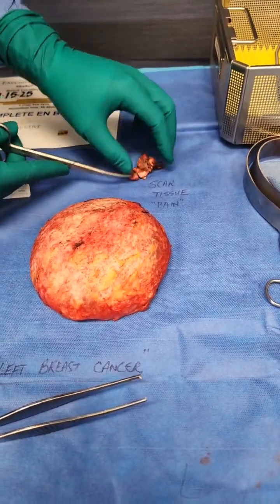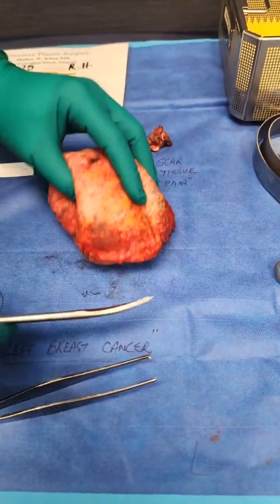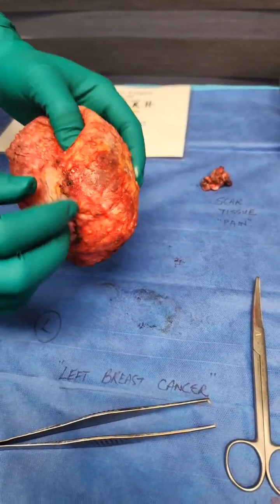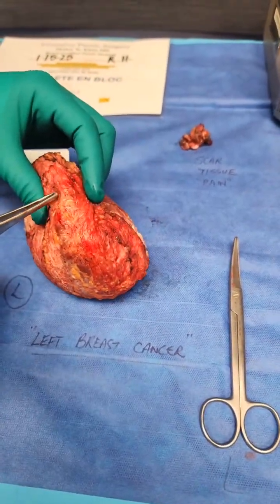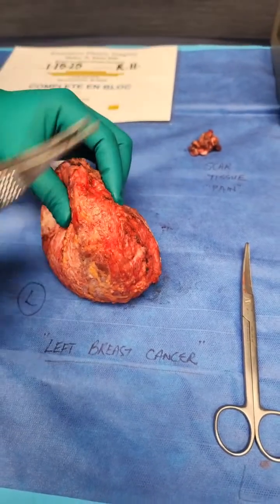And so I'm going to send this scar tissue because of the pain that she had. And you can see right here, I'm overall very happy with how the whole dissection has gone. And you can see some areas relatively thick. I put an X where I saw some suture. This was literally anchored onto the scar site.